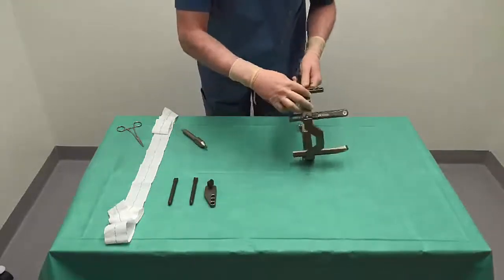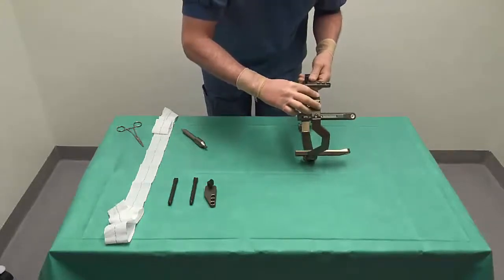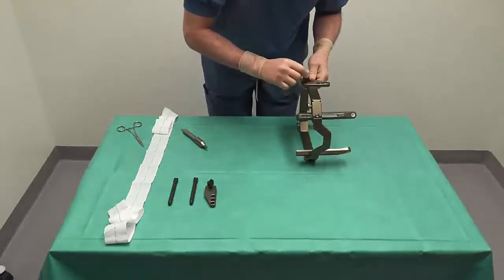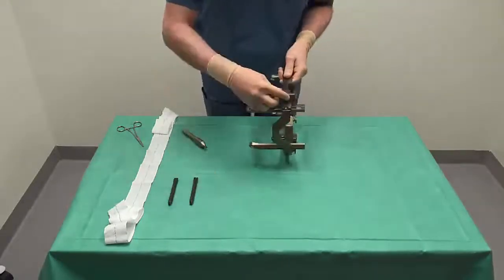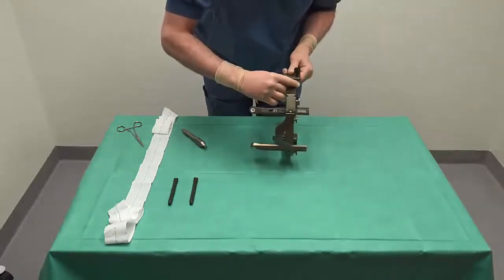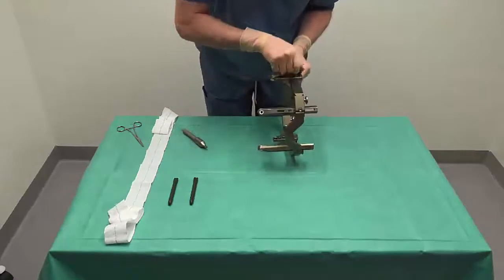We then slide the earplug holders on the frame. The anterior straight side is aligned at value 100 and locked. If necessary, this value will be changed when the frame is on the head of the patient.